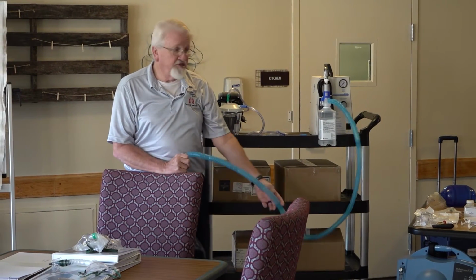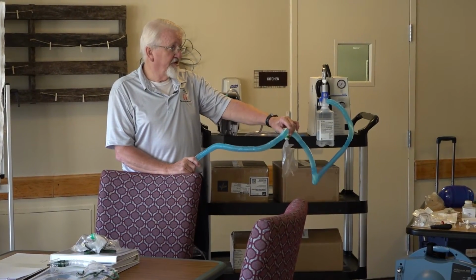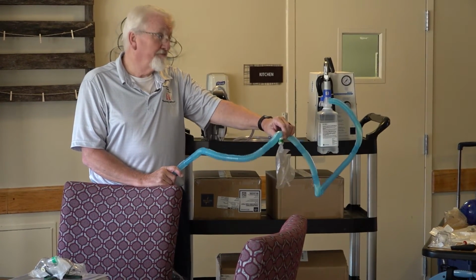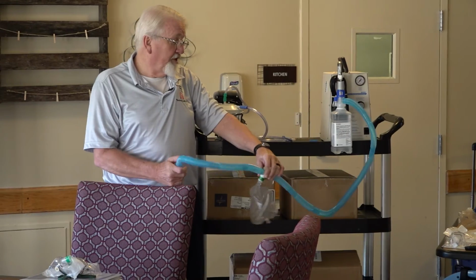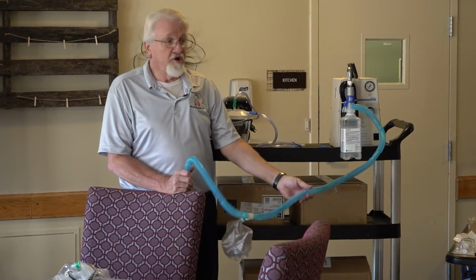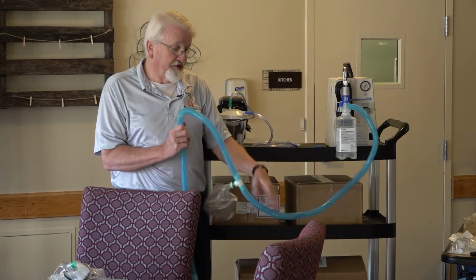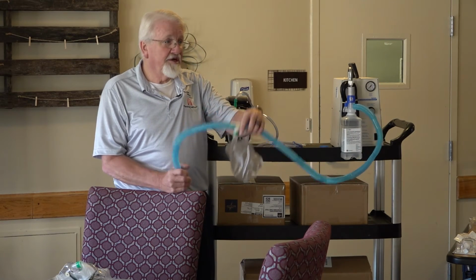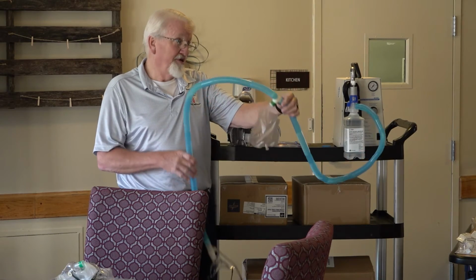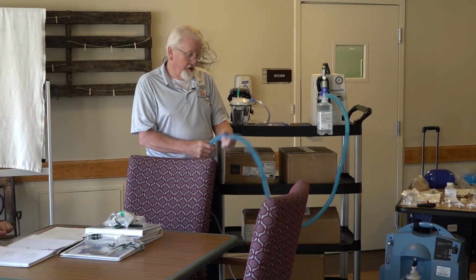Now, I've gone into patients' rooms, and true, it does keep it under control and out of the way, but I've seen it hooked to the handrail above the patient's head. And then we can't figure out why his SAT won't come up. We go in there and we hear gurgling like he's underwater scuba diving. That's because none of the water made it to the bag. It's all still here in the hose because we've not got it strategically placed. Okay, so the bag always needs to be at the lowest point.